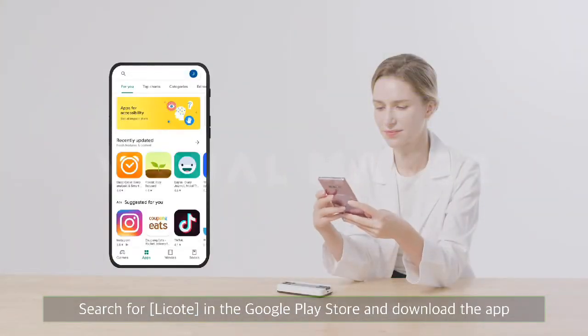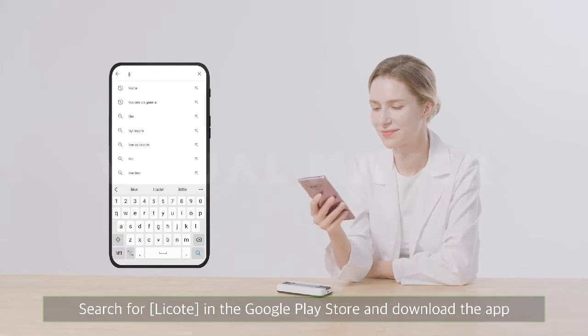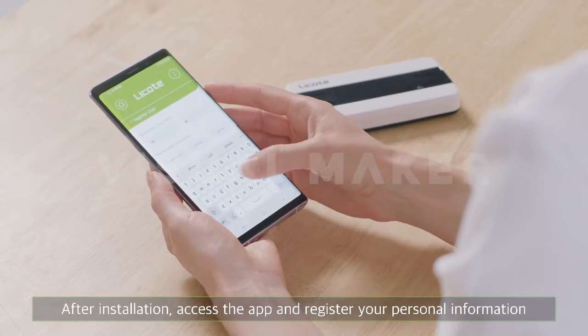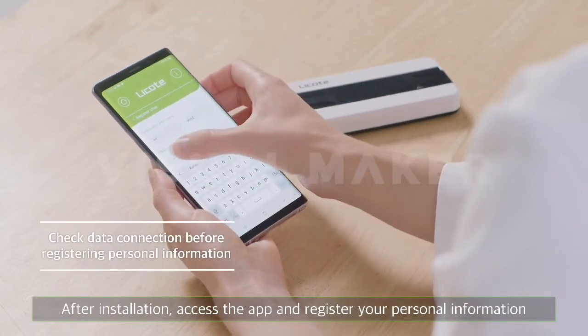Search for Licote in the Google Play Store and download the app. After installation, access the app and register your personal information.